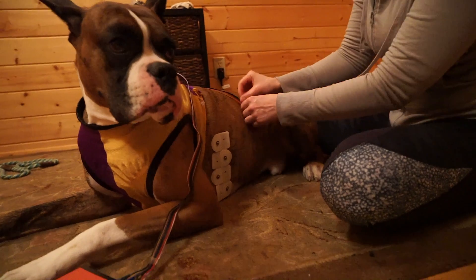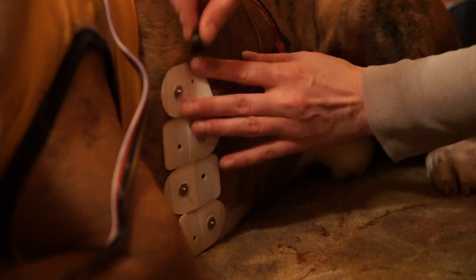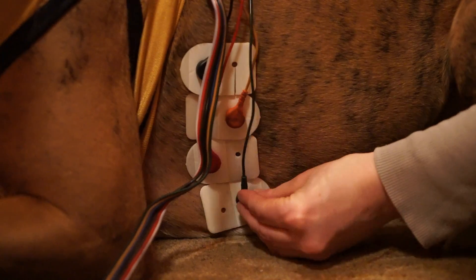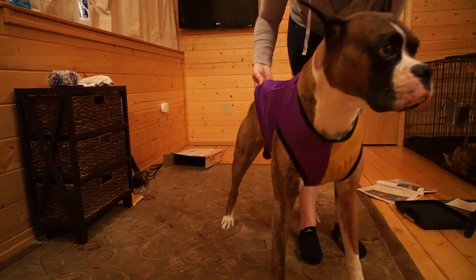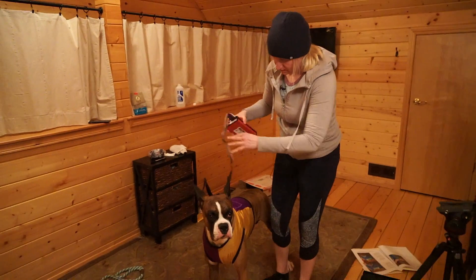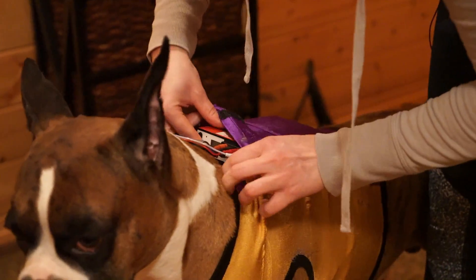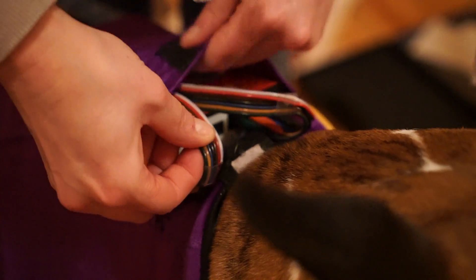On the left side we go black, orange, red, green. So black on top, then orange, the red one, and the green one. And we're going to stick this recorder into this little backpack here, and we'll stuff all these wires in as well. And you're set to go.